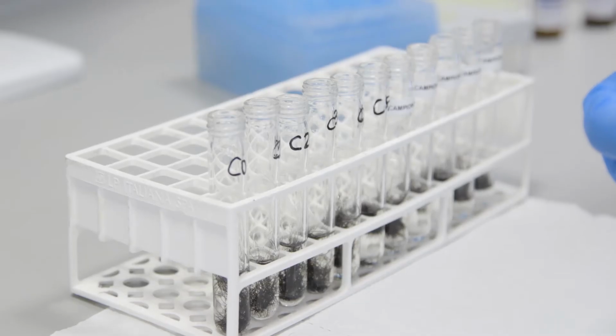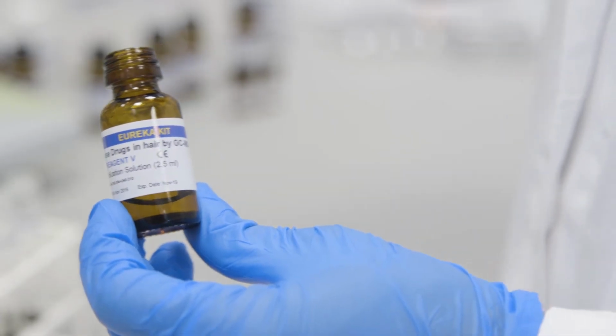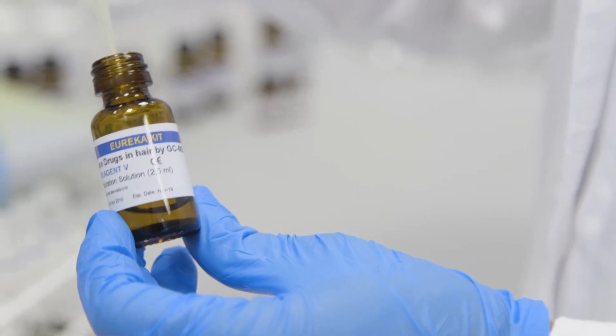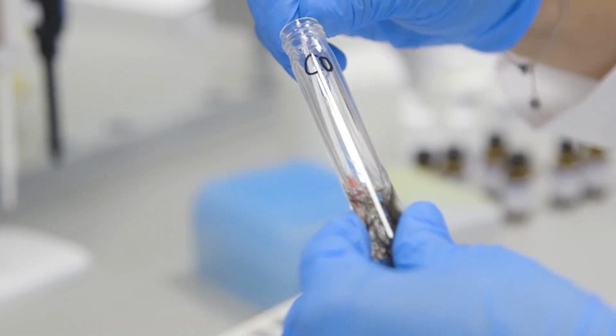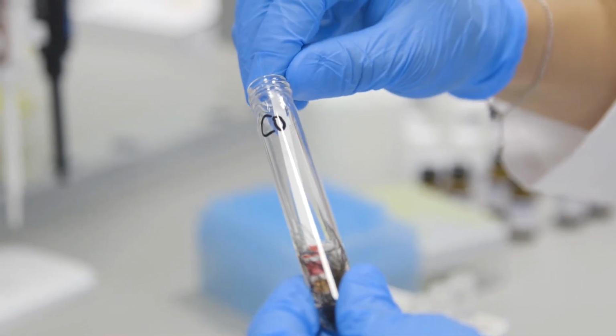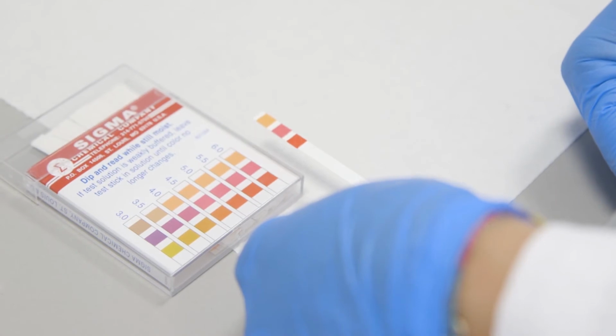The following day, we proceed with the cooling at room temperature, and then we open the glass test tubes. We add to each tube 2 ml of reagent B, buffer solution, plus 45 microliters of reagent V, stabilization solution, and we check that the pH is 6.0, more or less 0.2 pH, with litmus paper, or even better, a pH meter.